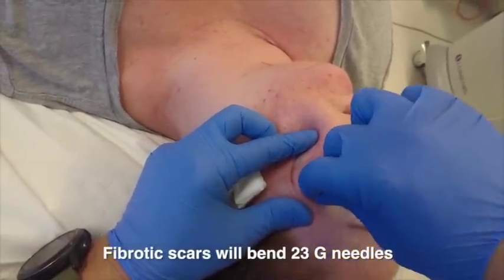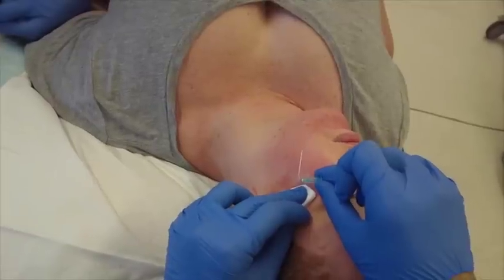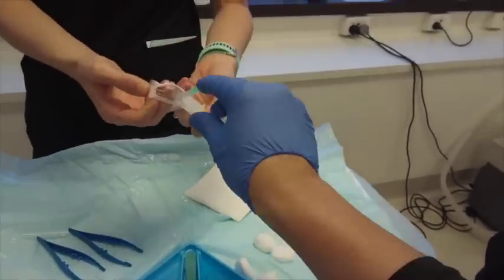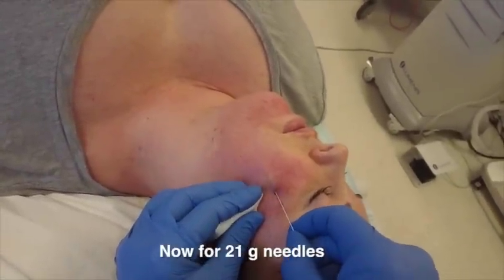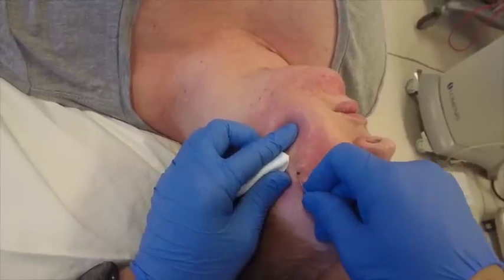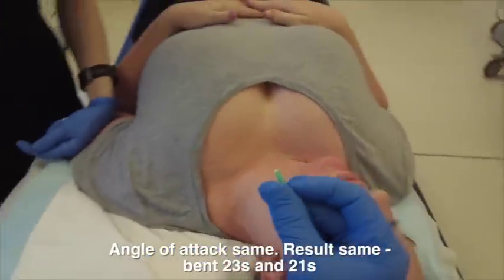I can start off usually with a 21, but in this case I'm just demonstrating fibrotic scars and how they can actually bend even 23-gauge needles. So we start off with a 21 normally — that's why in my notes it's a 21-gauge by default, sometimes a 23. Even 18-gauge needles have been reported by Australian dermatologists. However, the technique is always the same — basically it's the wiper technique.